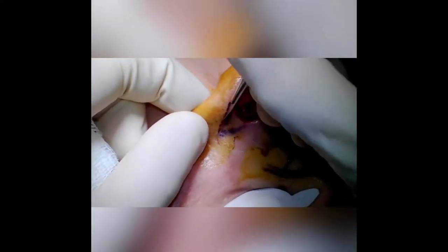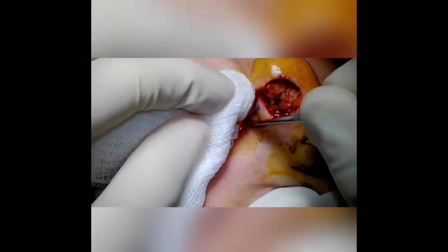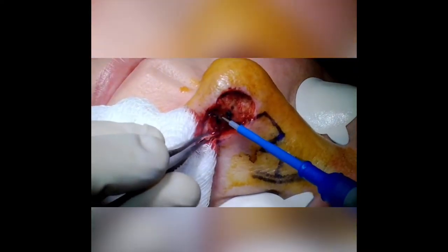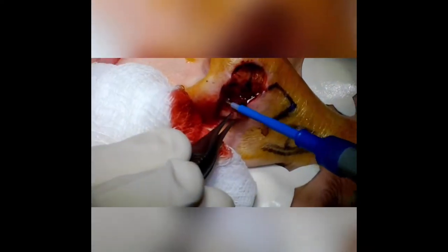Here we're doing a bilobe transposition flap for a Mohs defect. The patient had a 17 by 12 millimeter defect of her left nose. We've designed a bilobe transposition flap. The skin has been injected and she's under local anesthesia.